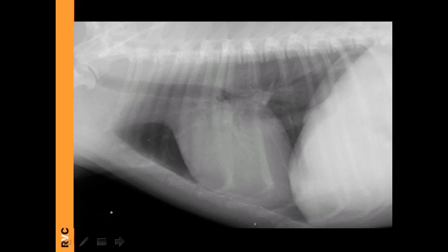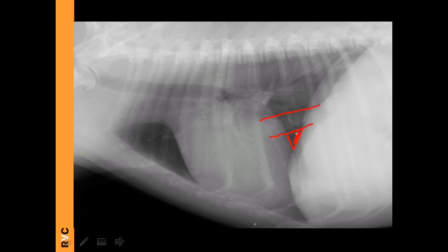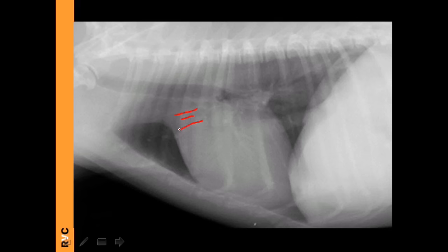The shape of the heart differs across breeds. Narrow-chested breeds have a taller heart, while barrel-chested breeds tend to have a more rounded heart. In cats, the right ventricle may attach more to the sternum than in dogs, and this increases with age. You have to acquire this knowledge with experience — seeing a normal radiograph, noting the breed, conformation, and heart shape. The caudal vena cava at the back, and the triangle between the diaphragm, caudal cardiac silhouette, and caudal vena cava, can give an impression of how well-inflated the radiograph is.